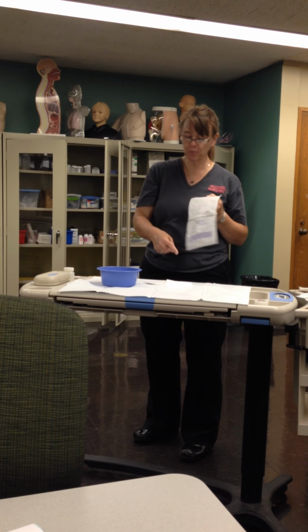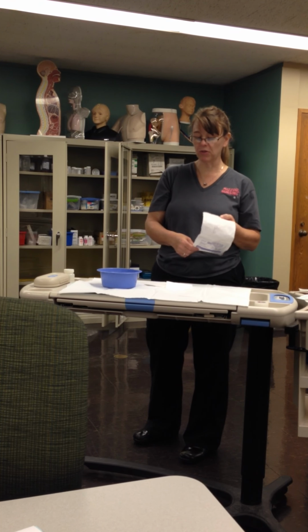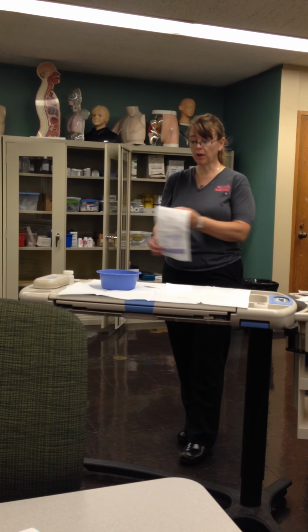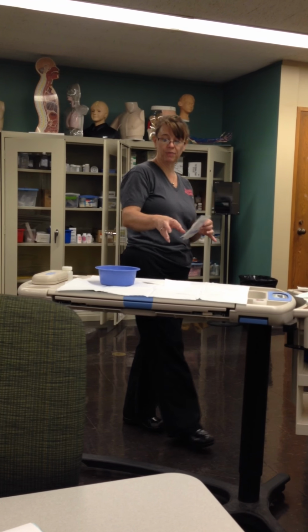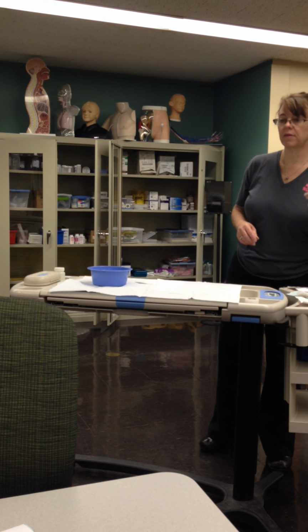So I'm reaching over. That's why I can do that over this, because would I be concerned about my sterile field? No, I can just not use it, but I'm doing that out over that. You could also come in from the side and try to dump it in your bowl, but like I said, there's really no need to, because when I put on my sterile gloves, then I can reach over and do whatever I want.